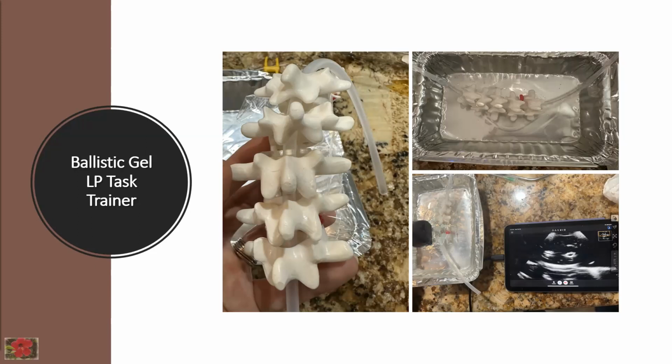Can I ask a question? If you use a slow cooker, once you melt the ballistic gel, you are going to pour it into another mold, yes? Yes, actually Karabeth uses the slow cooker. We have had this talk before, and she pours it in a mold and she doesn't have to get rid of bubbles. Karabeth, if you can unmute. Yeah, sure.